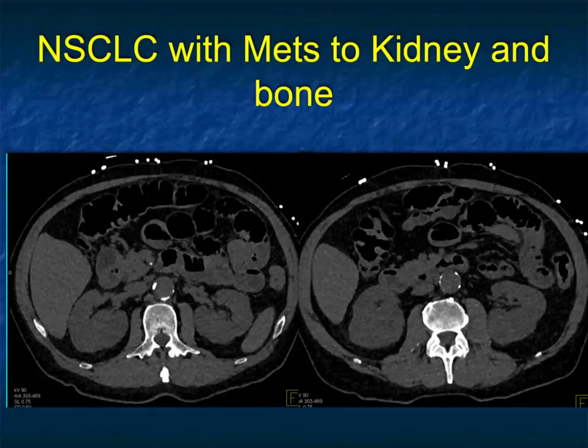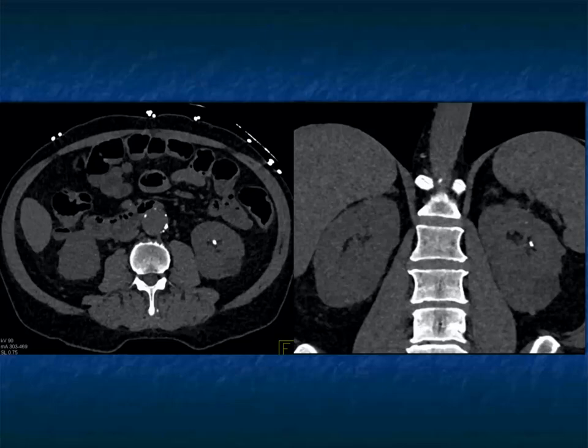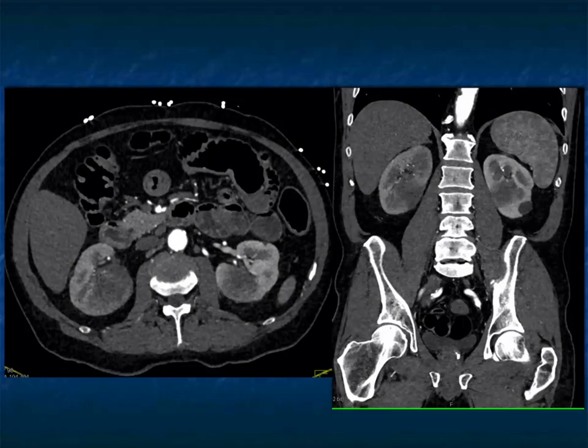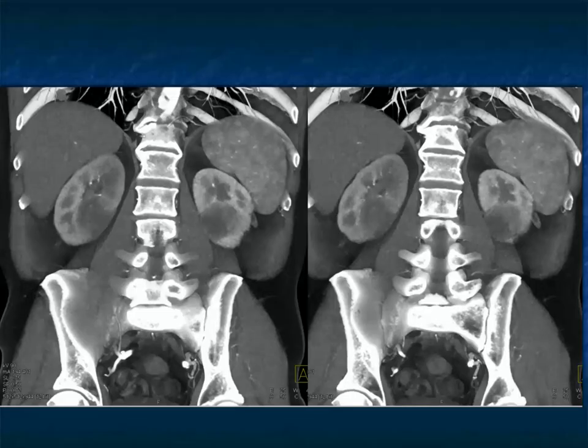This was a patient with hematuria and non-small cell lung cancer. We were restaging this patient. You look at the kidneys, they look a little bit full. And particularly at the lower pole, there is calcification in the left kidney seen. But then when you give contrast, bilateral masses are again seen. Looks again similar to the prior case. Again, if this was the only images, I'd be thinking about lymphoma. But metastases are a good thing to think about. And this was non-small cell lung cancer. Patient also has bone lesions.